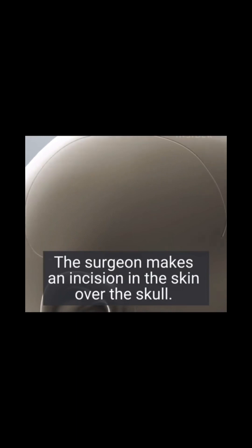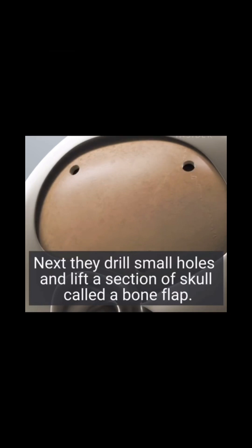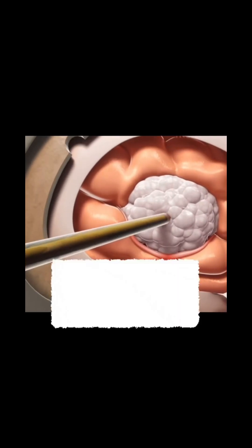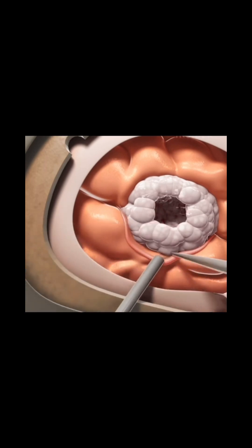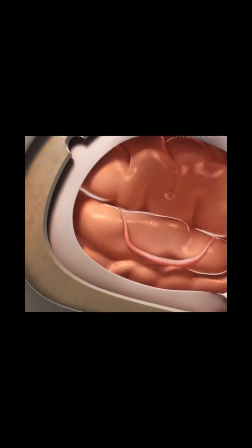Here's how we do a surgery like this. We make an incision overlying the region where the tumor is located, often using navigation with image guidance to help delineate where the incision will be made. We reflect the skin overlying the tumor and make small holes overlying where we want the bone removed. We then connect these with the drill to remove the skull and reflect the dura. Once the dura is exposed we can localize the tumor, debulk the inner contents, and then circumferentially dissect around the tumor differentiating between normal brain and tumor.